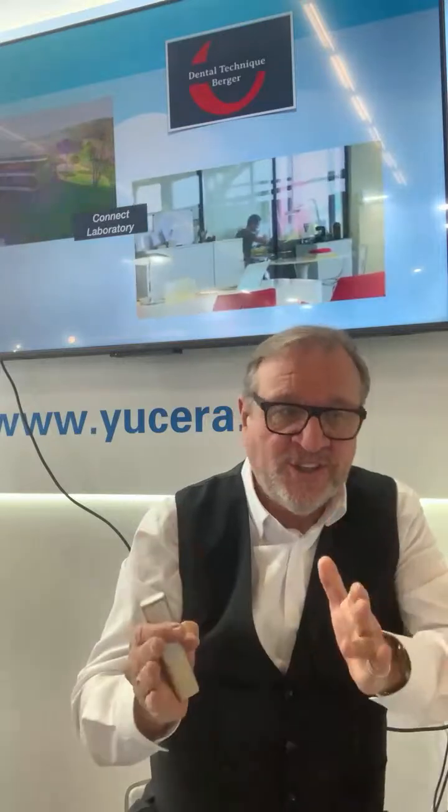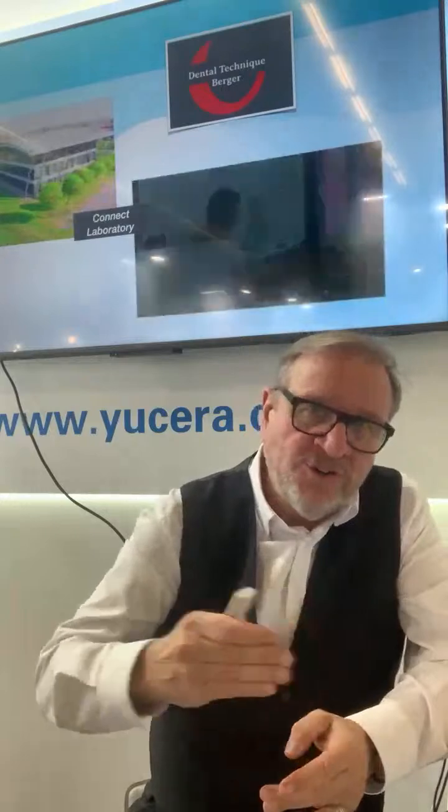I am a dental technician living in Metz, northeast France, and this is the last workflow to have such a nice smile design. My laboratory has been a digital laboratory for 15 years now, and the focus is to work digitally, using smile design, using mock-up and all the workflow to have 100% success at the end.